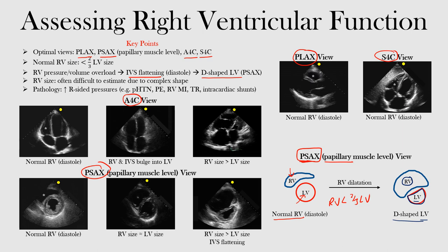Looking at the echo image at the papillary muscle level, all the starred areas highlight the right ventricle. After erasing those markers, this is your right ventricle and this is your left ventricle. We're at the papillary muscle level in the parasternal short axis view.